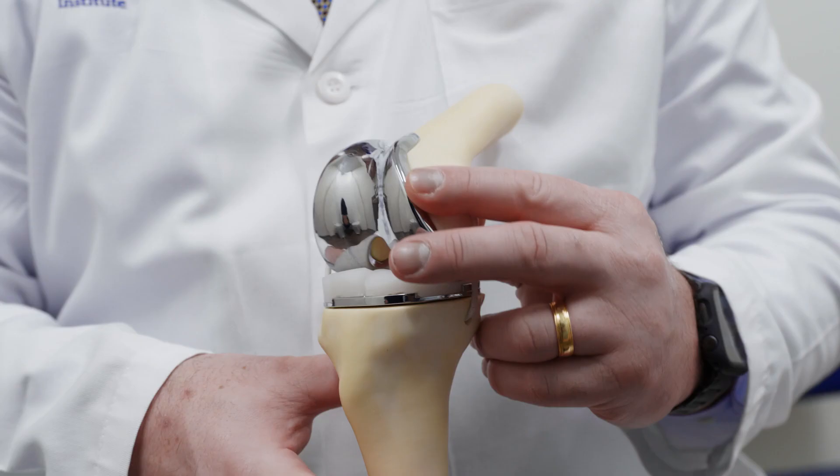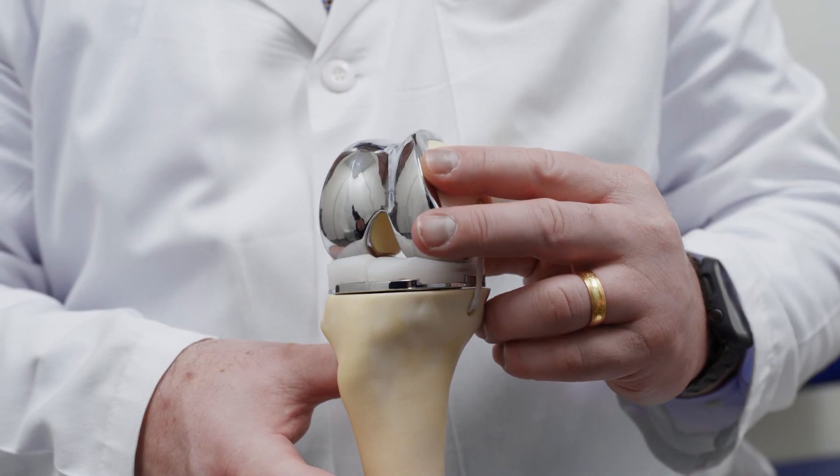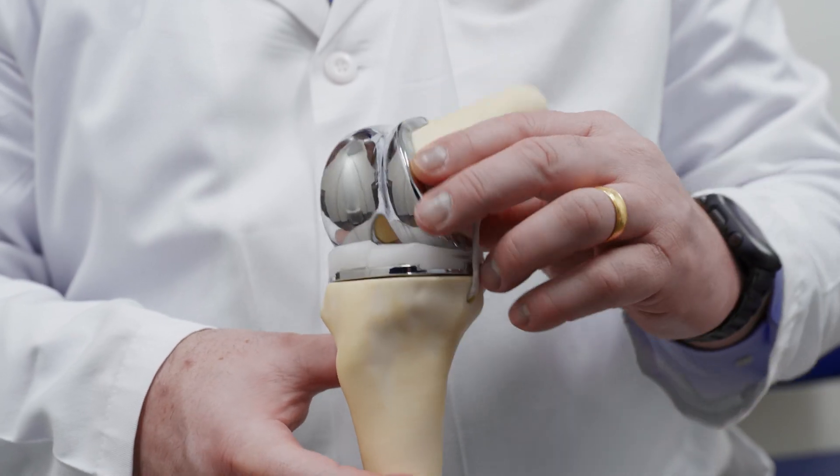The patient's knee feels more natural, the range of motion and rehabilitation are a lot easier for the patient, and it's a more stable implant.